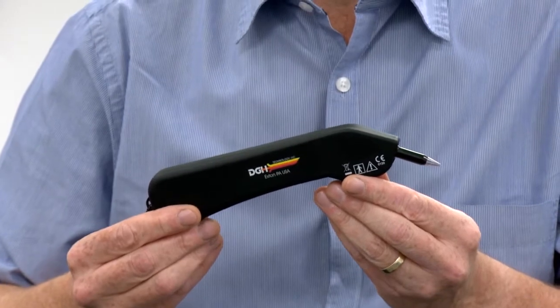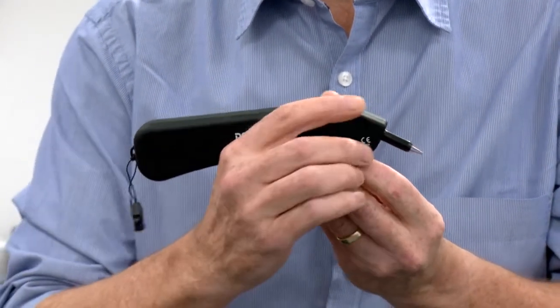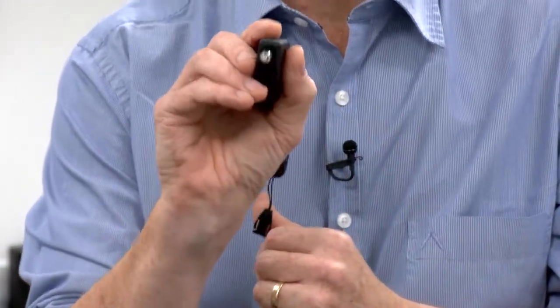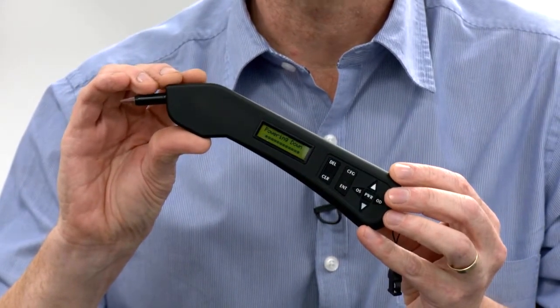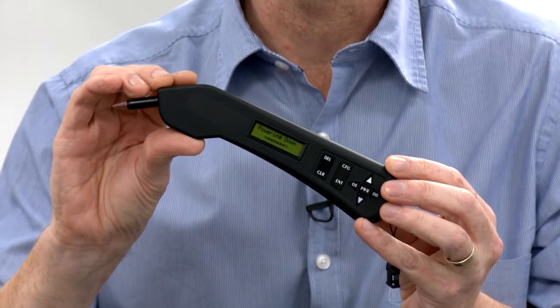Pachymetry is fairly easy to use and very easy to hold and operate. You basically hold it like you were holding a pen, touch it against the person's eye, then just read the readout. It gives you an average value and it's a very straightforward thing to do.